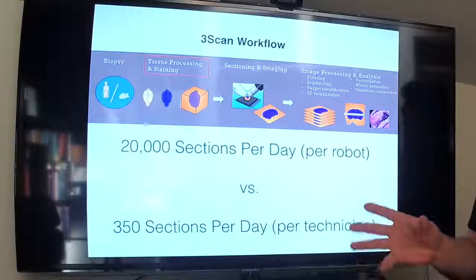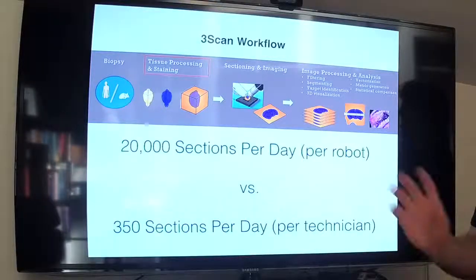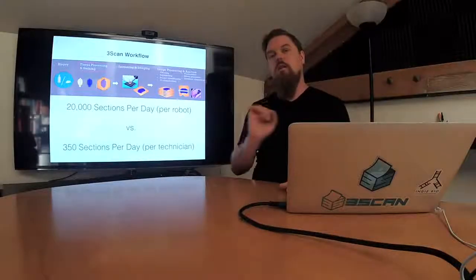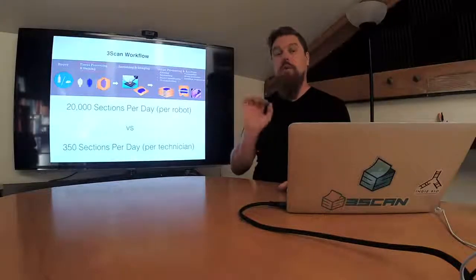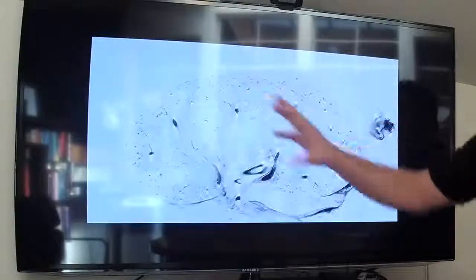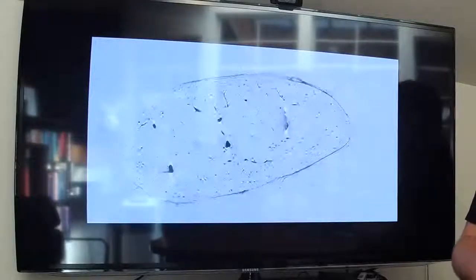So at this point, you probably want to see what some of the data looks like. So what I'm going to show you next is a mouse kidney where we have stained the kidney for blood vessels. And so what we're doing right now is we are flying through the sample. In black, those blobs, those are the glomeruli, which are the functional work units of the kidney. One of the things that you'll notice is that the features line up in 3D.